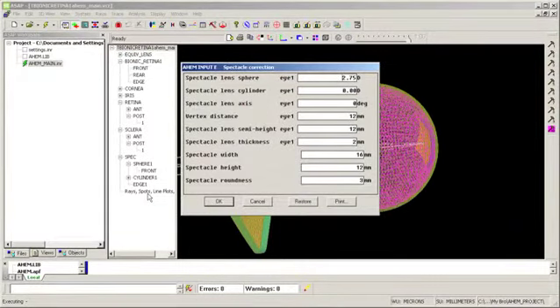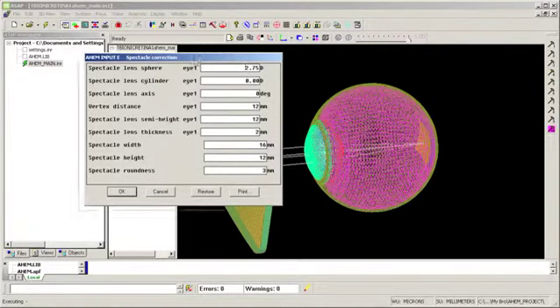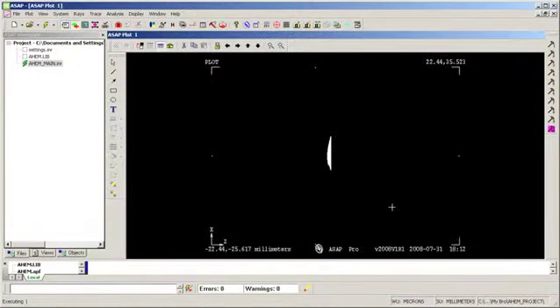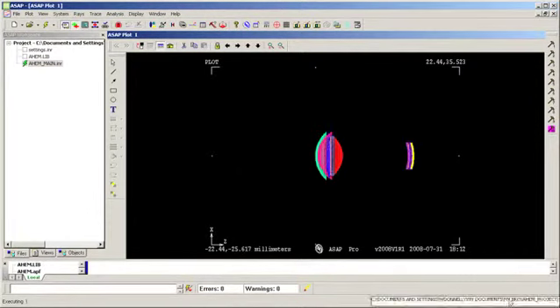Click OK. And from what I was describing before, we need to correct for the eye because we put a surface on the retina which moves that image to a different location. So I put 2.75 diopters to correct that, and I used optimization to find that number. So I insert some sphere, so I'm going to put power on the eye from the corrective lens. Click OK, and it begins to run its trace.